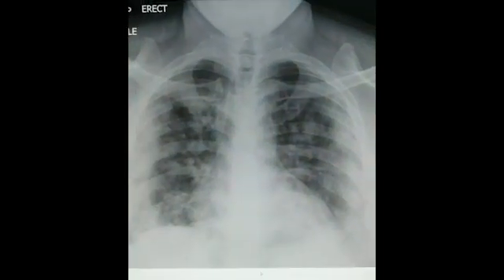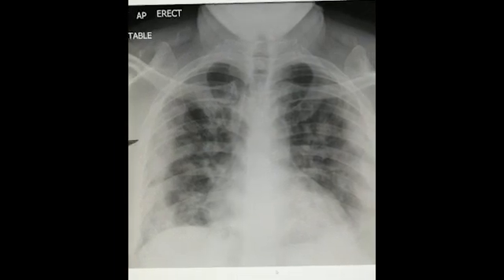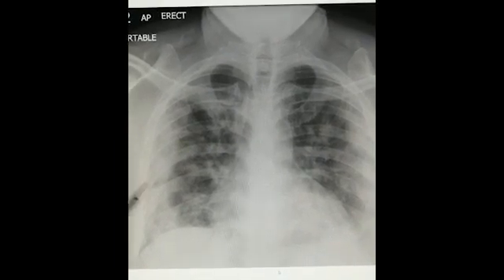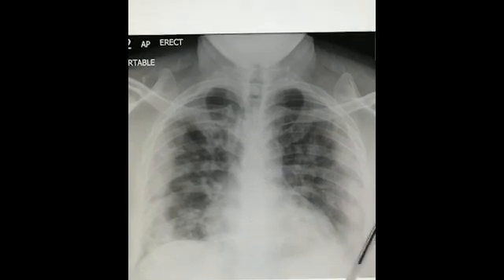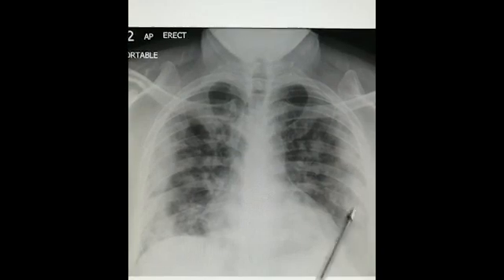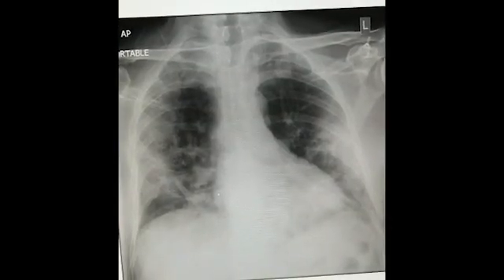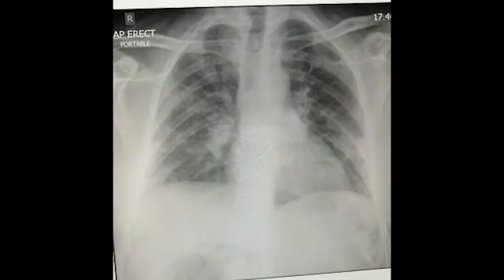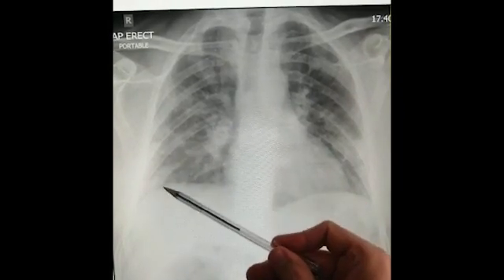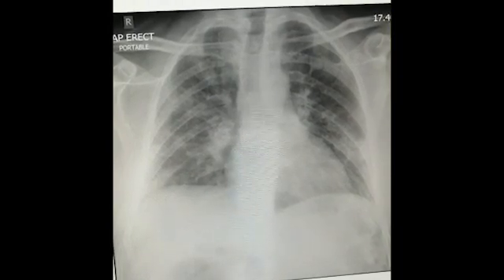Moving on now to a classical coronavirus case — this is a 68-year-old man. What you can see here is the peripheral patchy consolidation in the mid and lower zones, obscuring those nice rib markings from the previous x-ray. This is almost always bilateral, as you can see on the other side — very much the same thing. It's patchy and it's peripheral, and unfortunately we see this again and again.